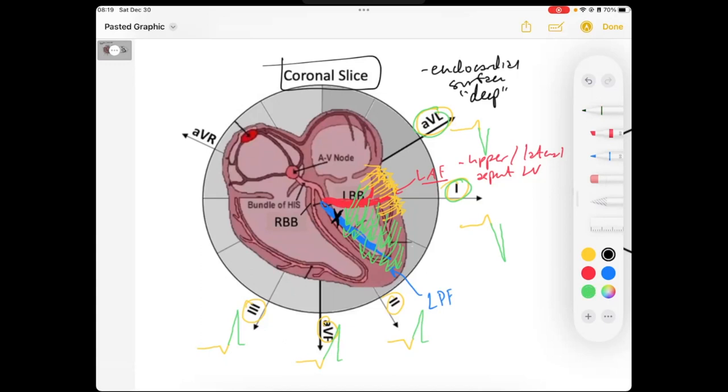Notice our axis. We have right axis deviation. So you'll see right axis deviation in the left posterior fascicular block. So you need to rule out right ventricular hypertrophy as a cause before you can say that this is a left posterior fascicular block.